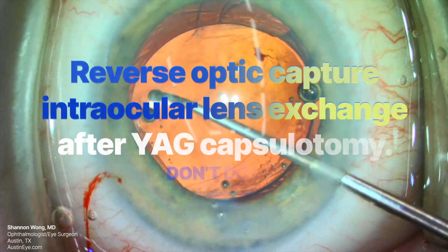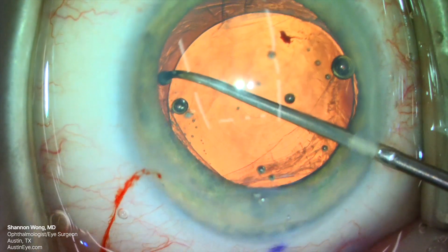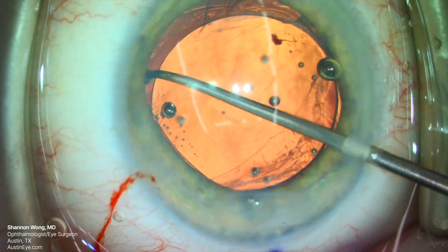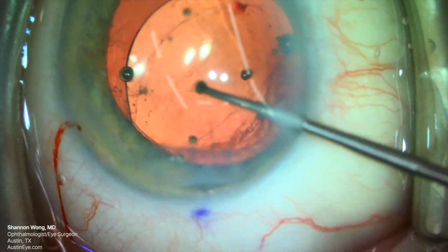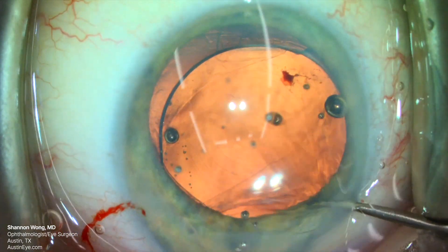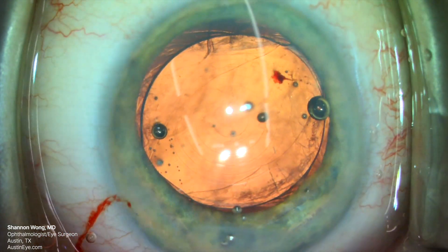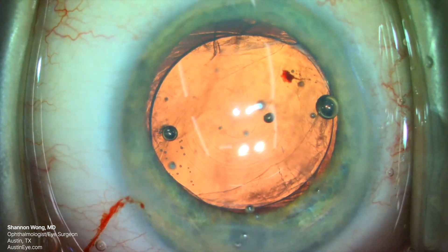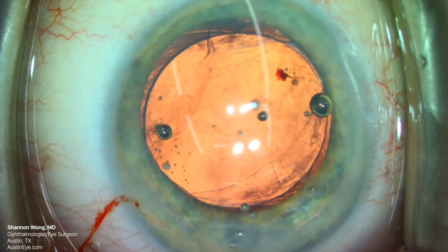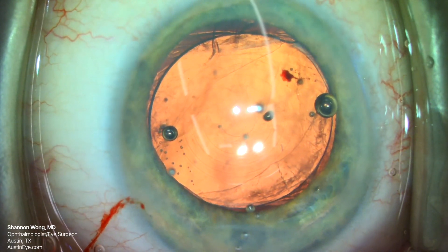This patient has had prior intraocular lens exchange after YAG capsulotomy. She's also had prior anterior vitrectomy surgery. Her current PanOptix lens implant is in a reverse optic capture configuration, where the optic is anterior to the anterior lens capsule and the haptics are behind the anterior lens capsule. I'm about to show you what you should avoid and not do after reverse optic capture when there's no posterior capsular support.